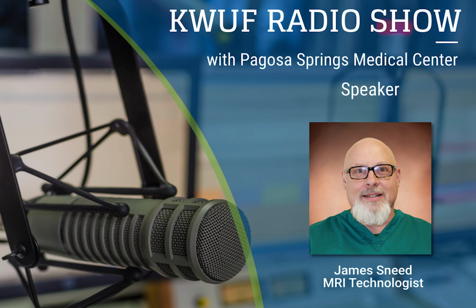Another important thing about MRI is that there is no radiation. It uses radio waves to see soft tissues in the presence of a large magnetic field. And we have basically a radio antenna for all body parts.